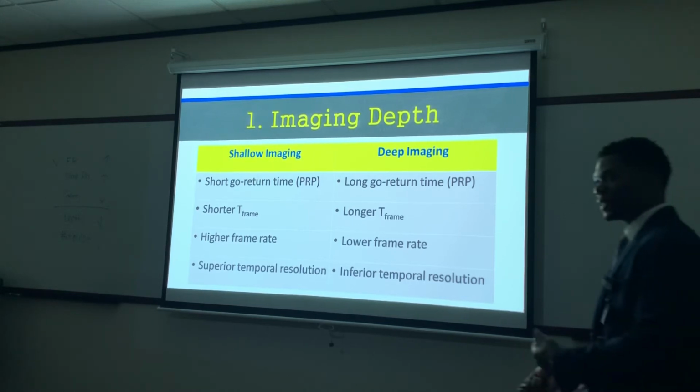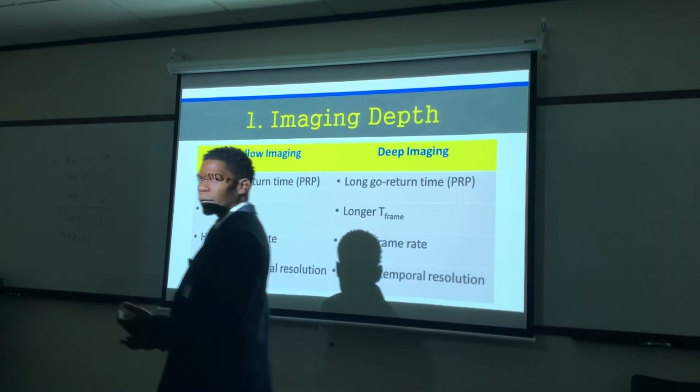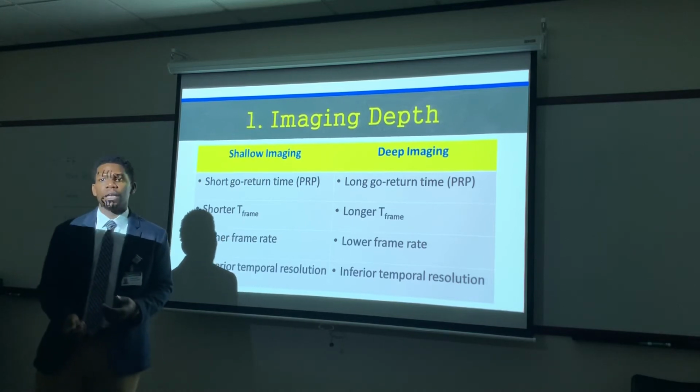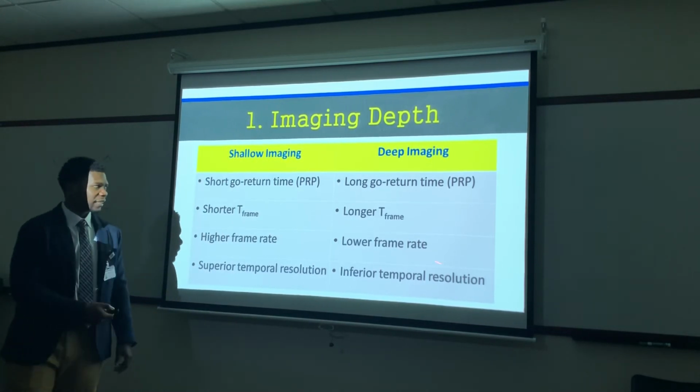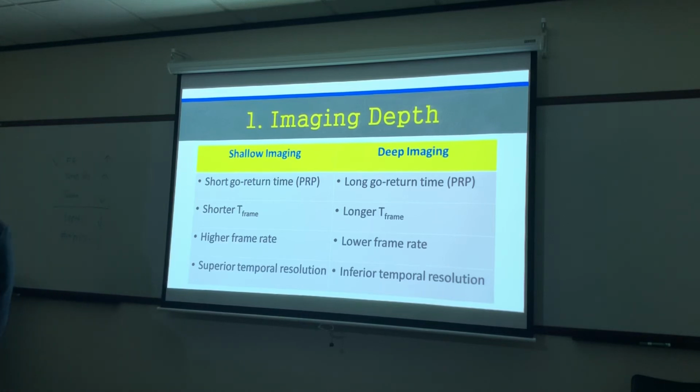Any questions on imaging depth, guys? Say that again about something being inversely related. I said T-frame and frame rate are inversely related. Remember, that's that special relationship. They have a reciprocal relationship. If you read my little handout, it's real quick-hitting facts. Make sure you check that out over the weekend when you do your homework.